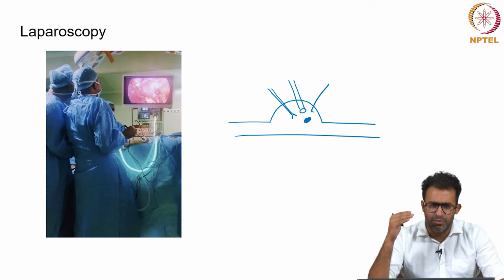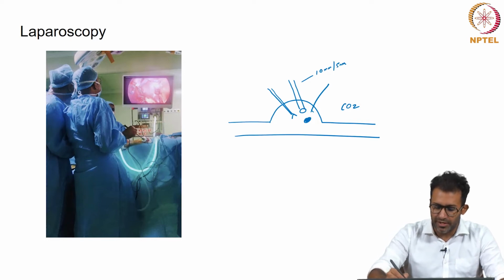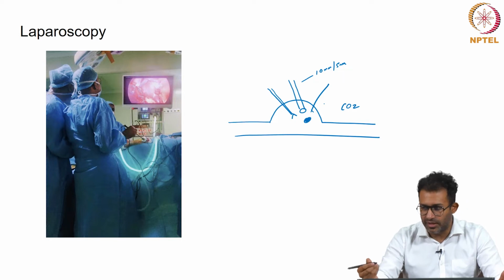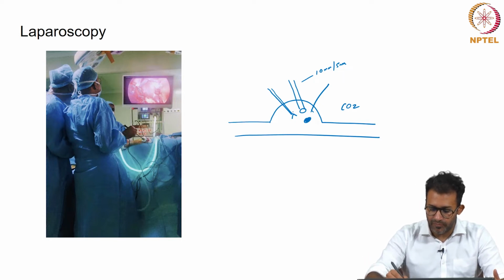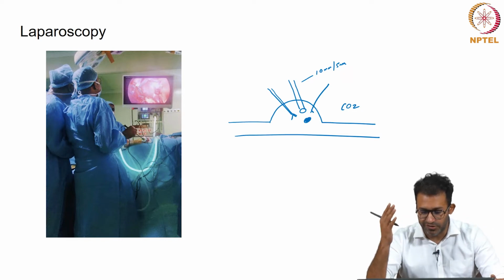These days, we perform a whole gamut of procedures through laparoscopy. As you can see in this diagram, this is the abdomen, and you inflate the abdomen with gas, which is usually carbon dioxide, and put in a camera. This is usually a 10 mm or a 5 mm camera, and then you have working ports, 2, 3, 4 depending on how you use them, and these can involve graspers, needle holders. You can suture, you can cut, you can remove things.